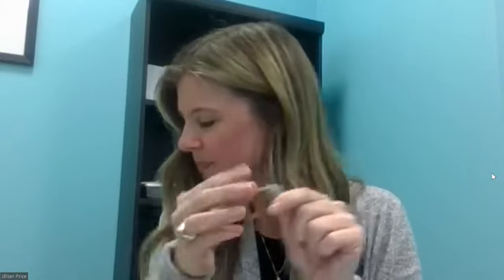And this will sometimes have to be changed as well, especially if the hearing aid is not fitting properly. If it feels like it's popping out of your ear, or it's too tight, or it's pulling, then the length of the receiver might be wrong. So we have different lengths, 1, 2, 3, 4, 1 being the shortest, 4 being the longest, and then we have 3 powers. We have 60, 85, and 100.